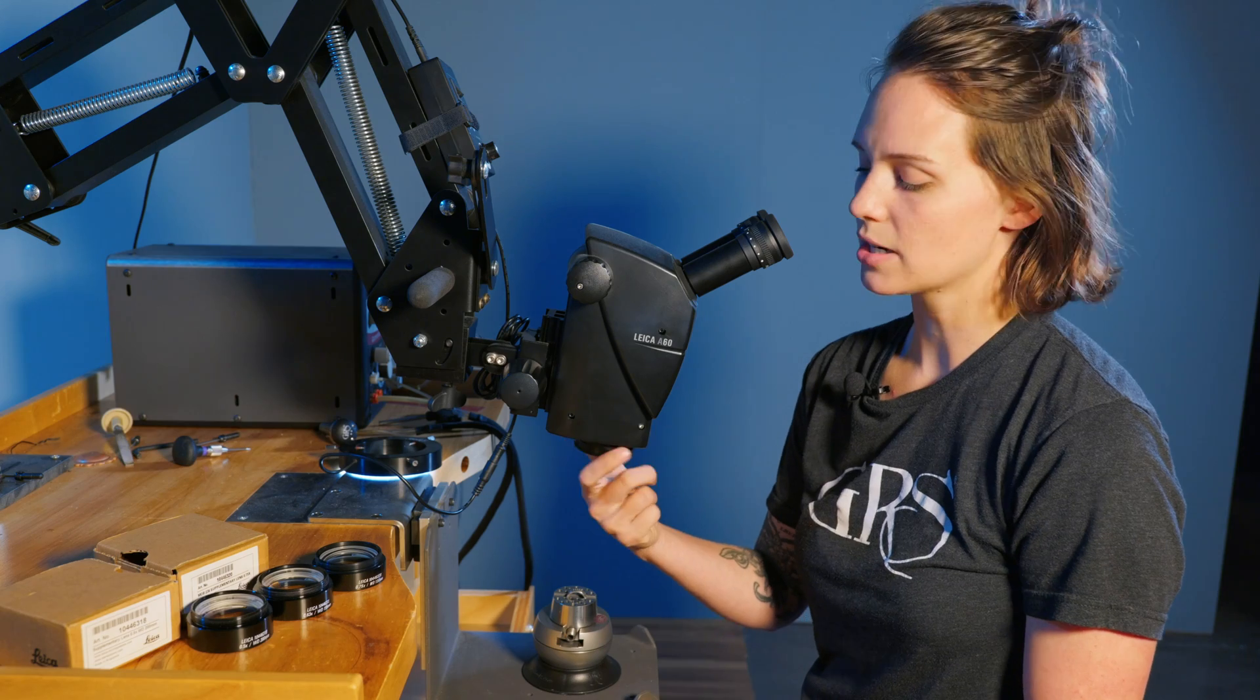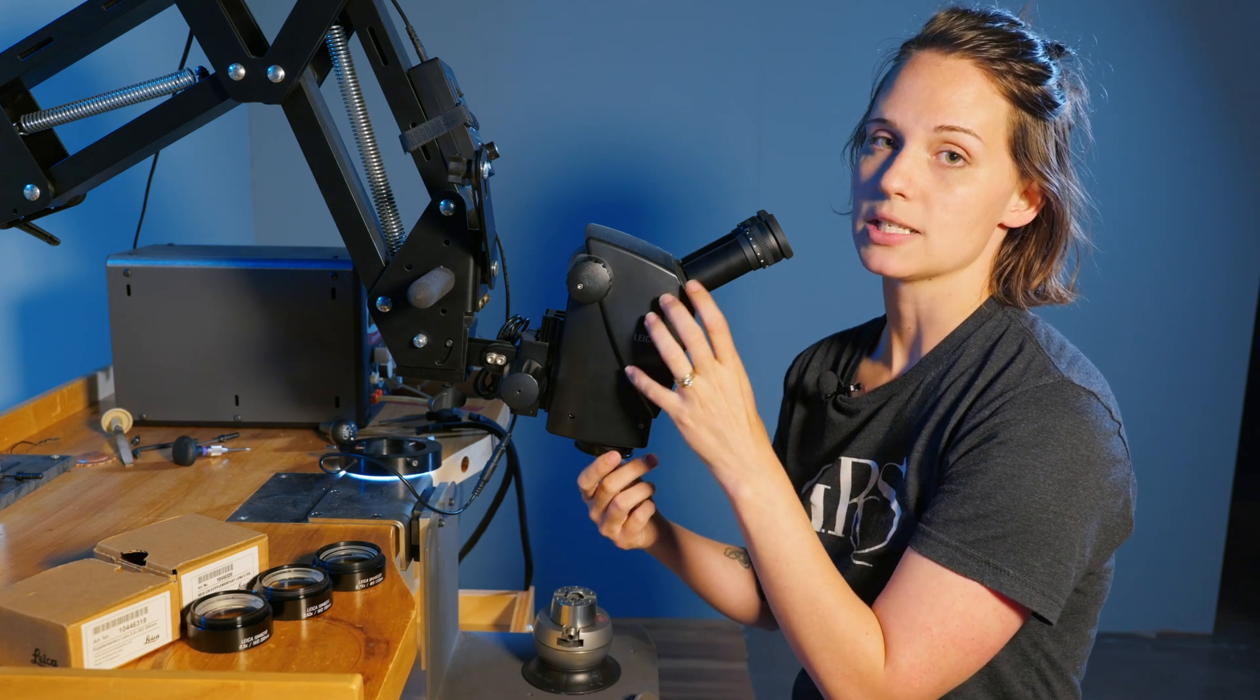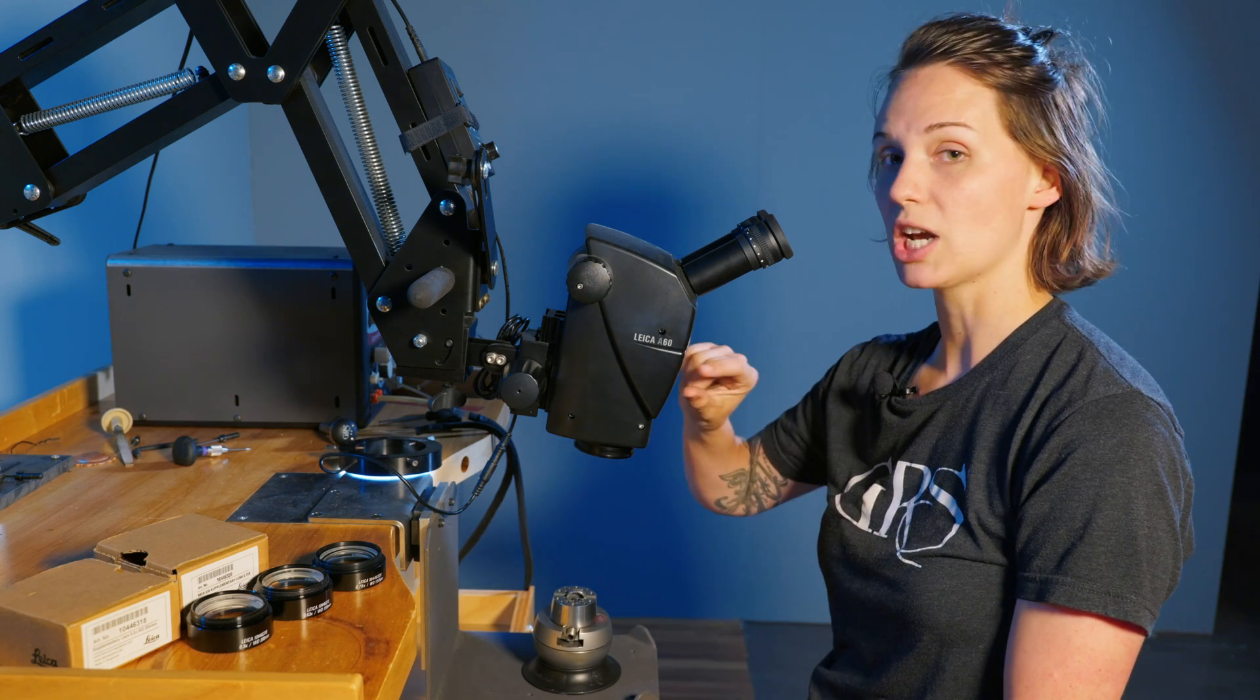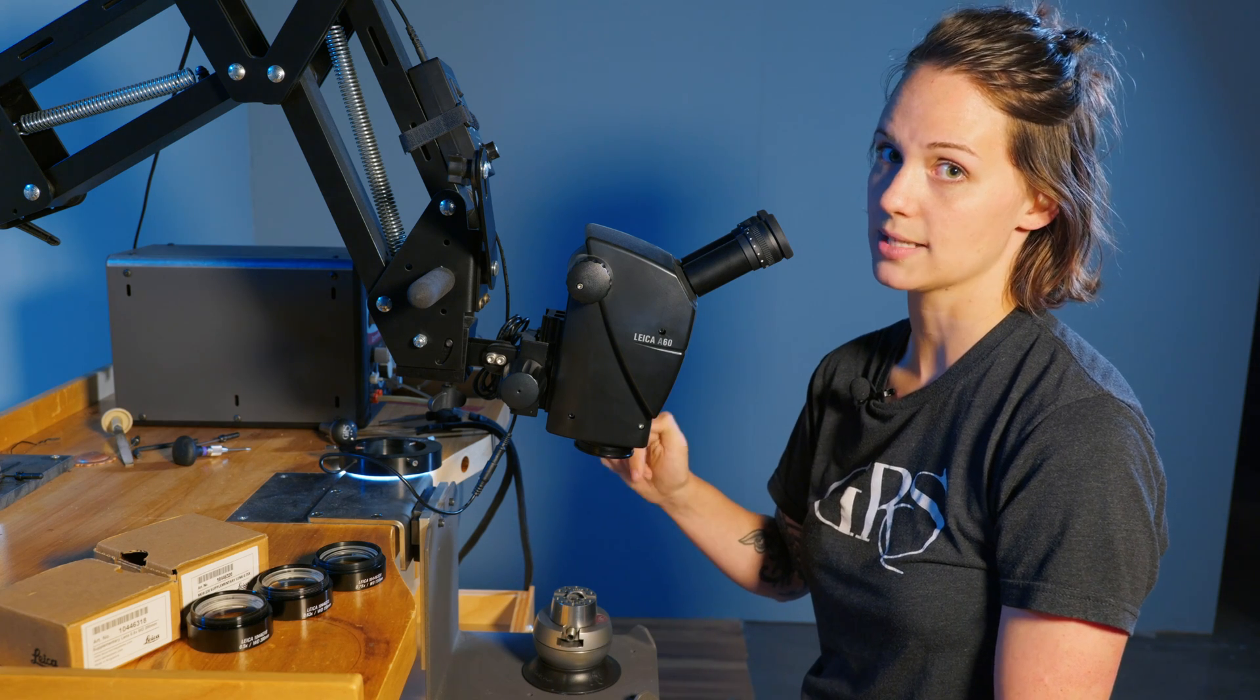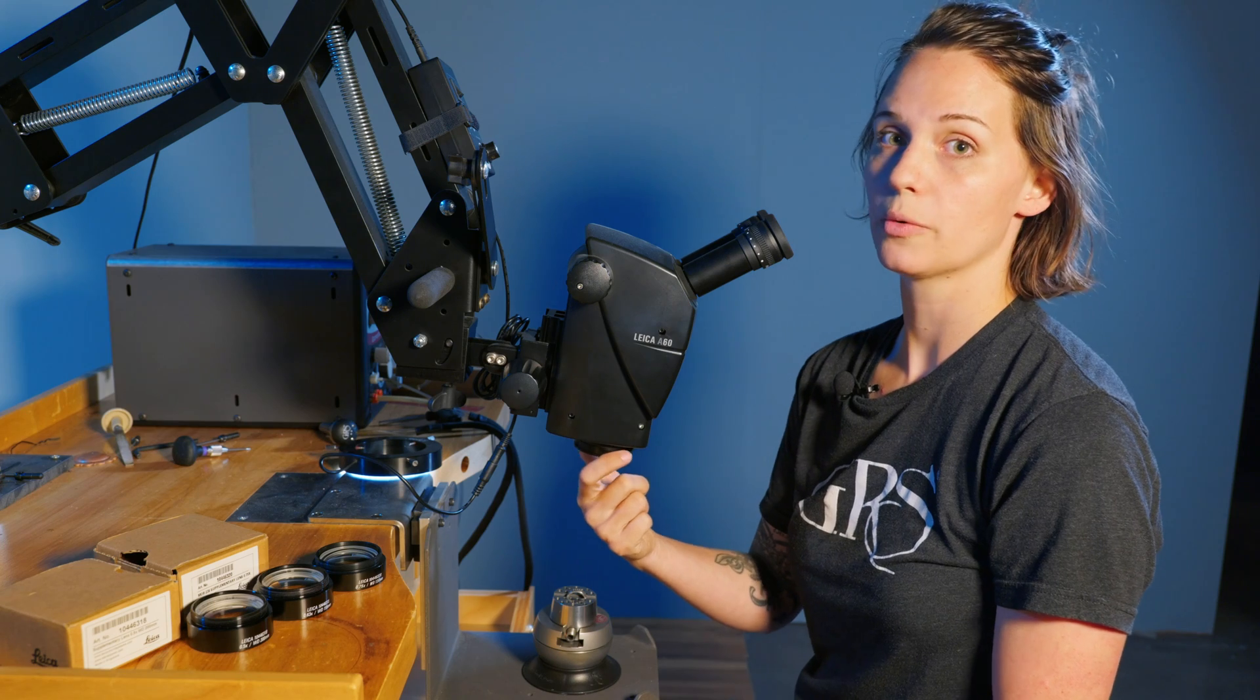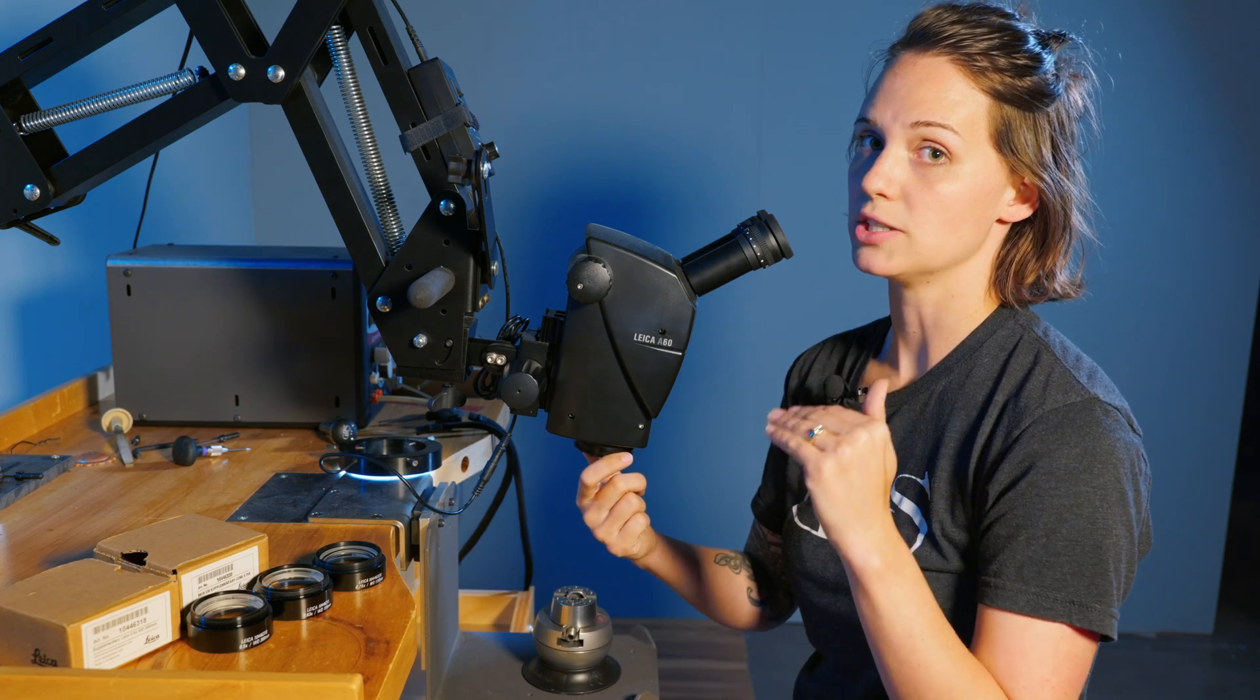The first thing we need to talk about is this adapter ring. These lenses were not designed for the A series microscope, so you need this because otherwise the objective inside of the microscope would actually hit the glass of the lens. This allows you to have a little bit more wiggle room and allows you to use the full range of your magnification.